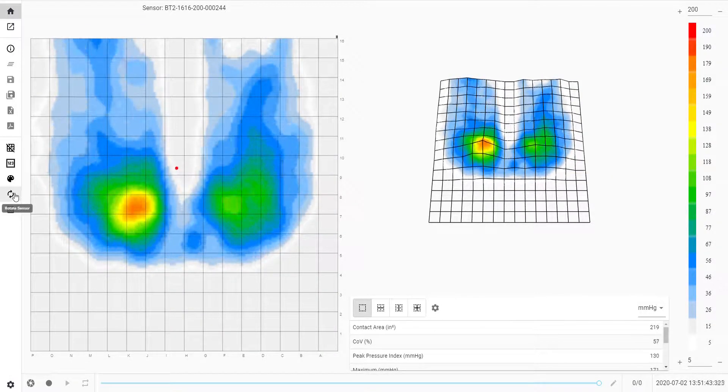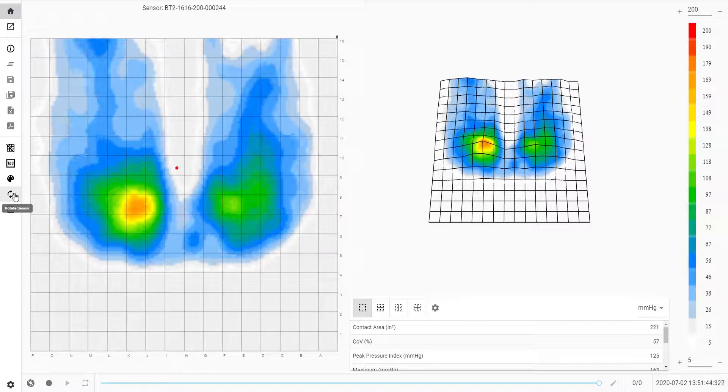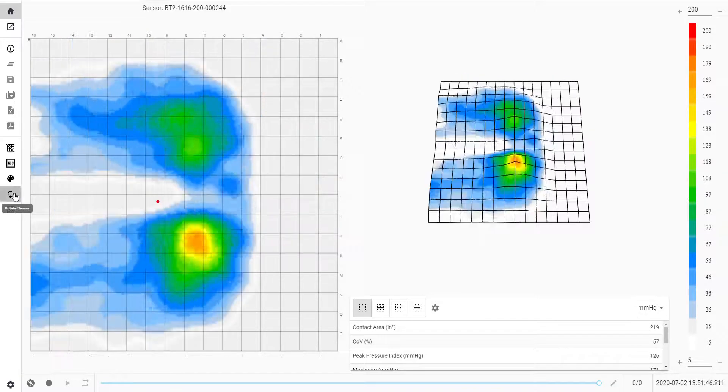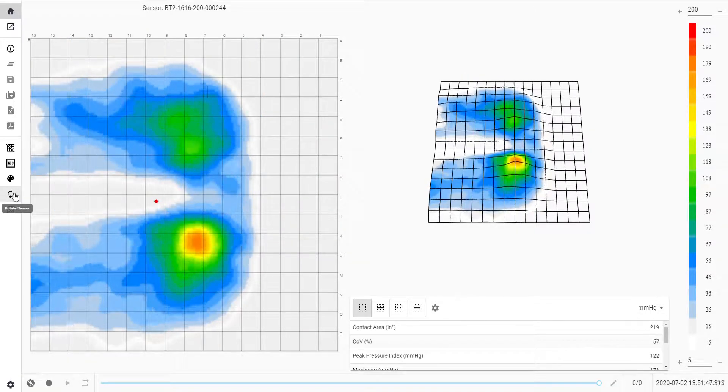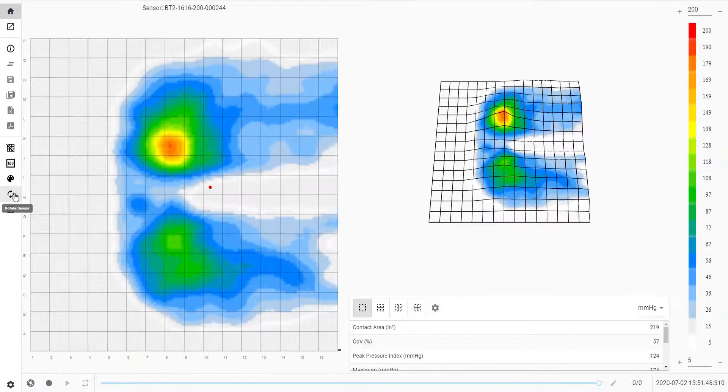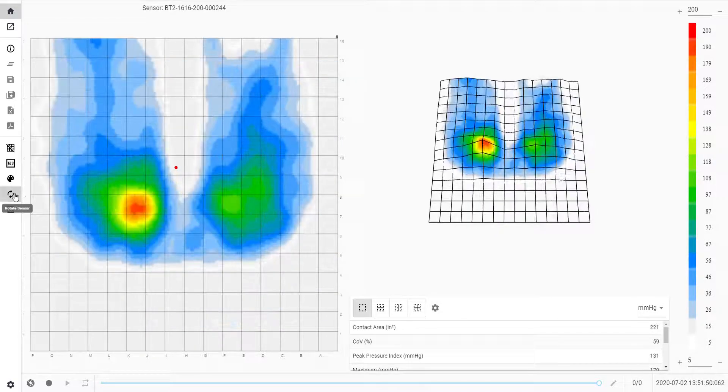Next is the rotate icon. Here you can rotate the sensor map by 90 degrees each time for a different orientation.